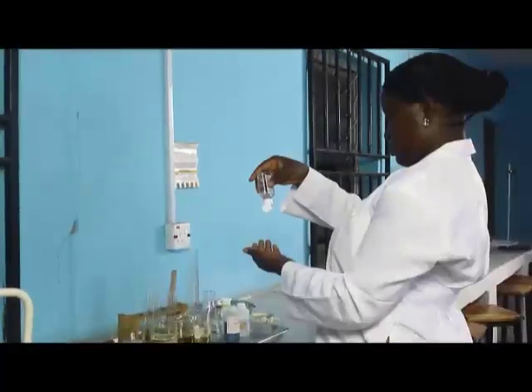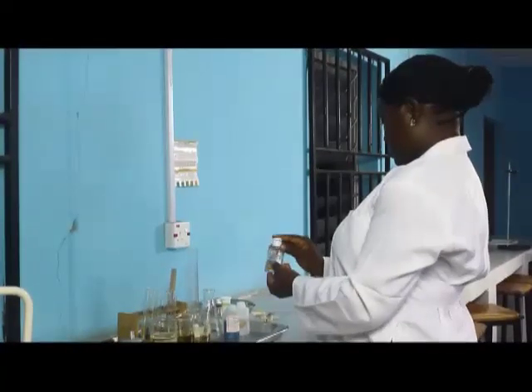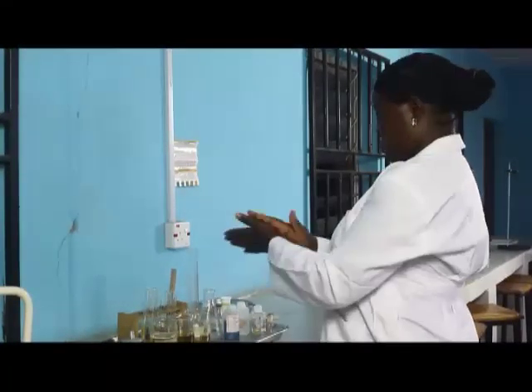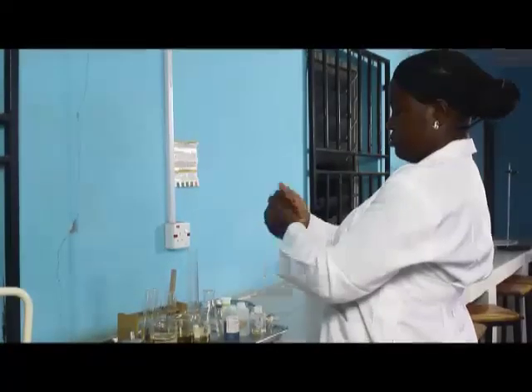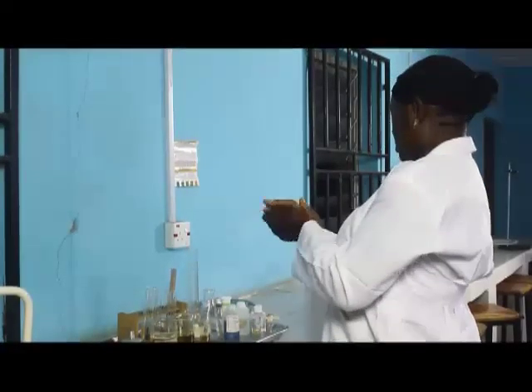Testing and stool examinations. The importance of macroscopic examination of urine and stool cannot be overemphasized in the microbiological examinations for the diagnosis of infectious diseases.